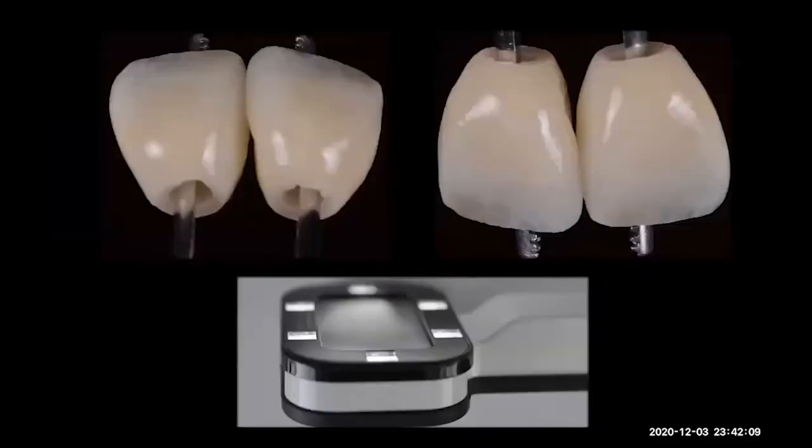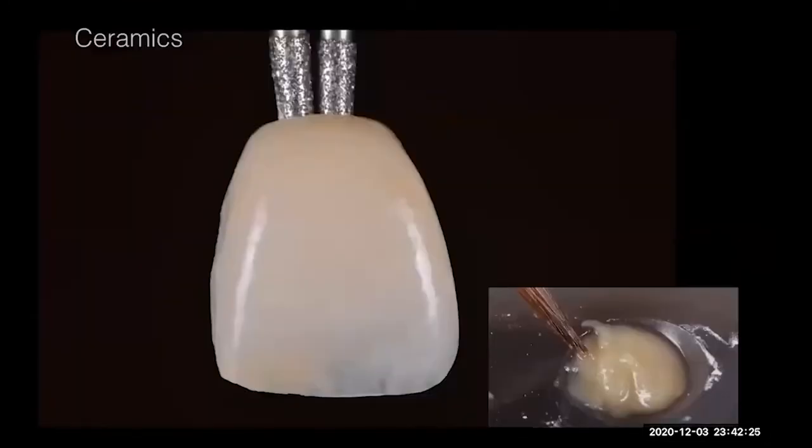This is our stain technique. We control with our polarized camera from Smileline. We calibrate the polarized effects that it gives me in the picture, and then we start using some coloring.